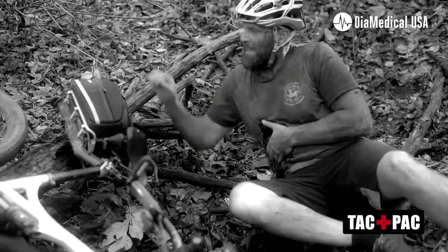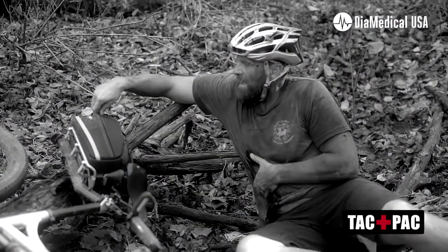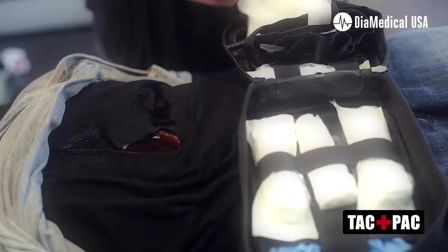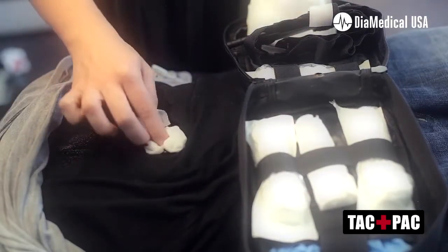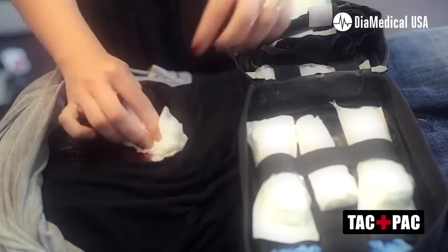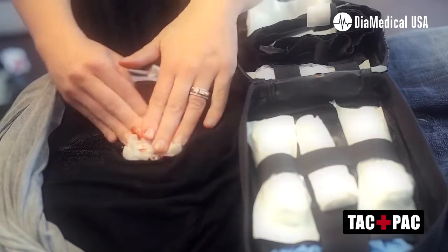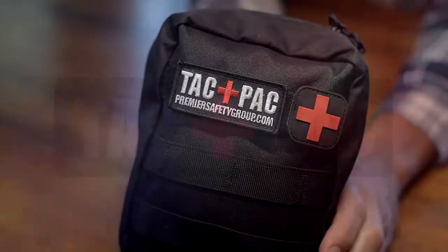If the victim has a wound to the chest or the abdomen, you would not apply a tourniquet. Instead, you will pack the wound using your packing from the Tac Pac. Apply the gauze into the wound firmly and snugly, applying pressure until the bleeding is controlled.